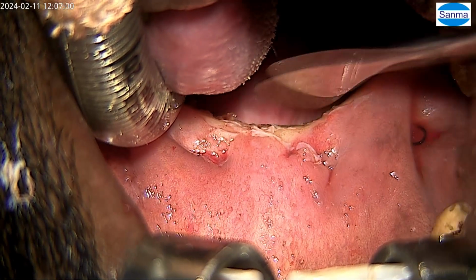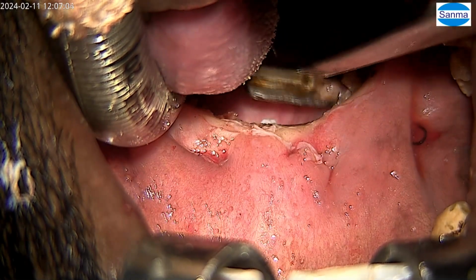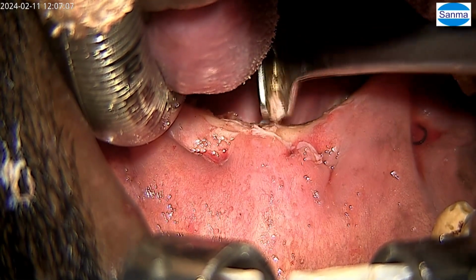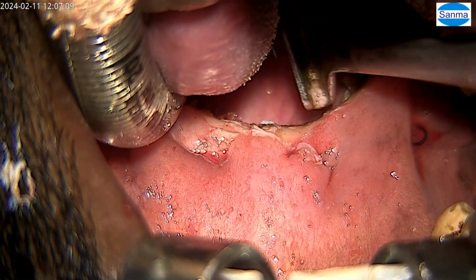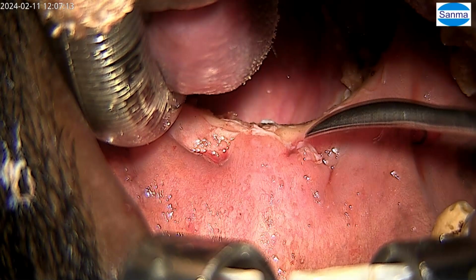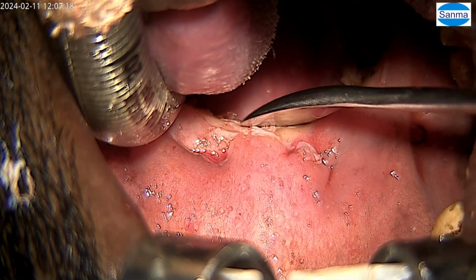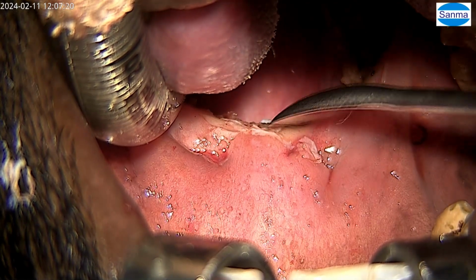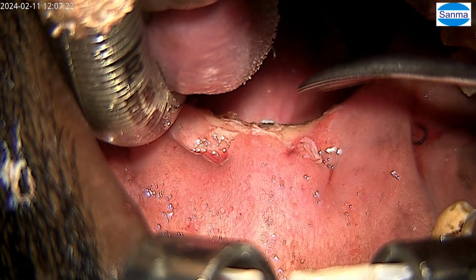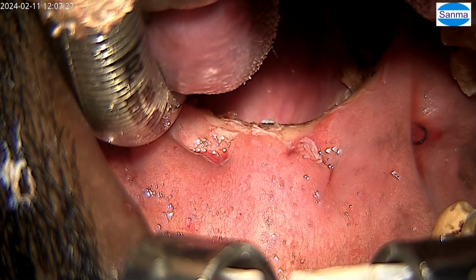See, a little bit of mucosa here on the palatal side is already preserved. Sometimes you can actually preserve a little bit more of mucosa and close it. But all those things will not really make too much of difference if you use coblation. You saw, I hardly ever used coagulation. It was only ablation. So ablation will give least fibrosis. So the globus sensation is much, much less, and it's not a real major problem for patients. I've been operating for so many years with coblation. So that's my take on that.